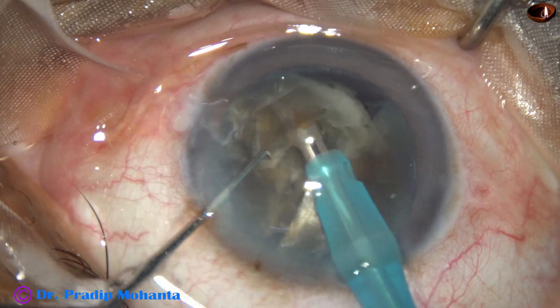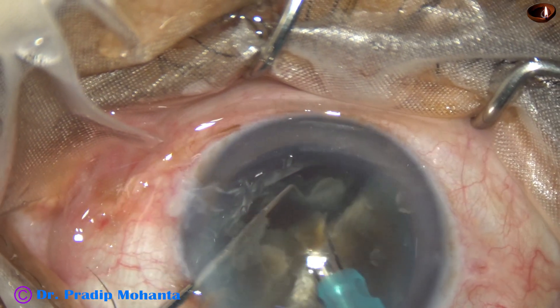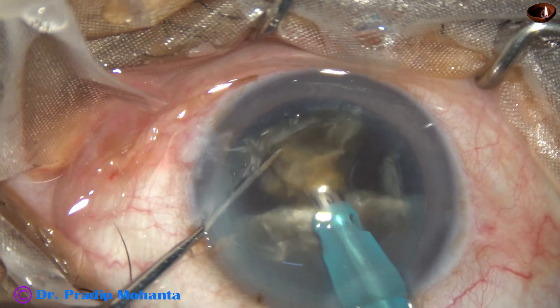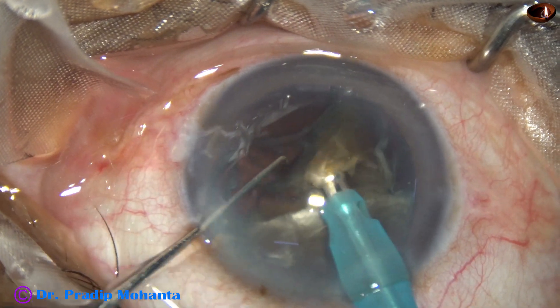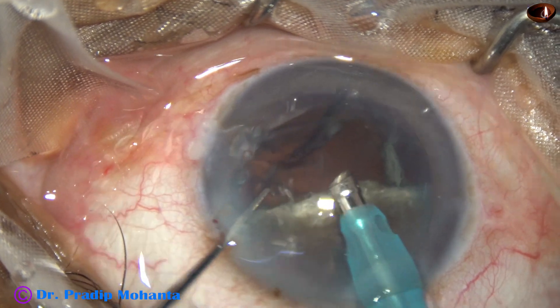When we tilt the piece, the epinucleus goes down and it protects the posterior capsule. The pointed tip of the large hard triangular piece does not put pressure on a single point on the posterior capsule.